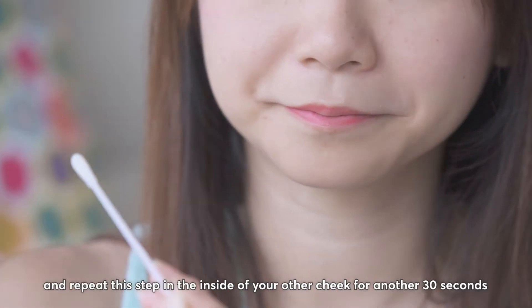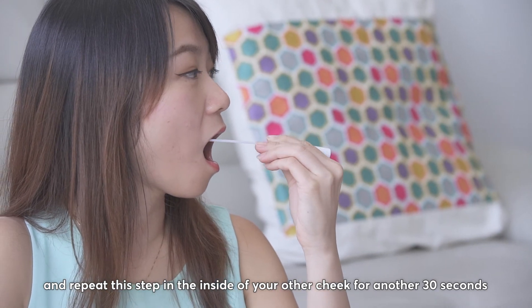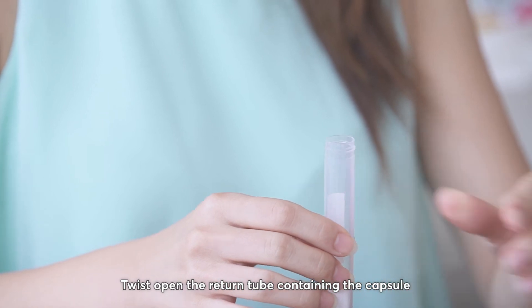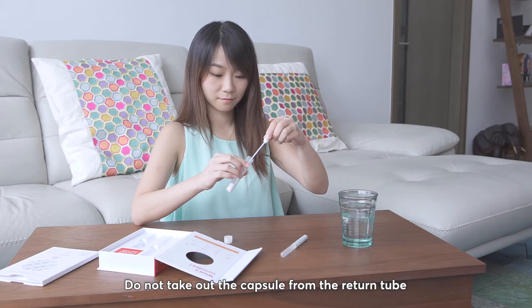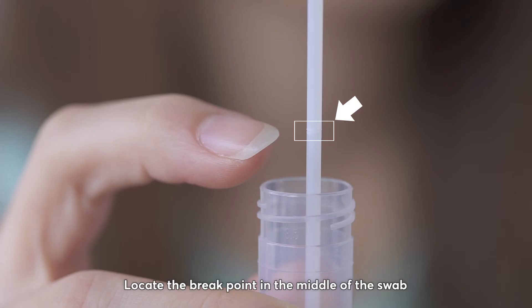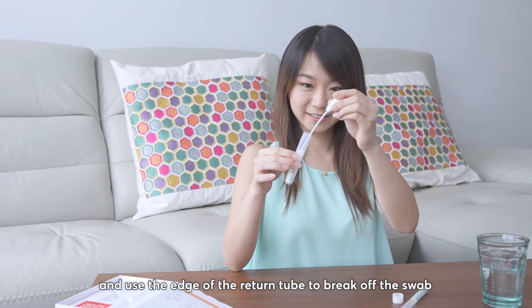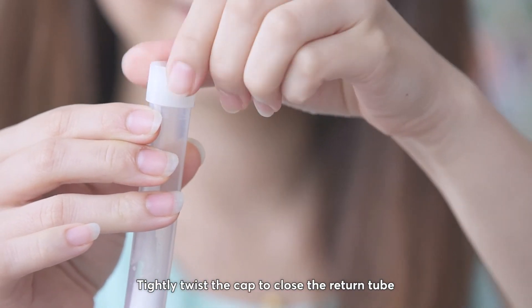Use the same swab and repeat this step on the inside of your other cheek for another 30 seconds. Twist open the return tube containing the capsule and carefully place the swab inside. Do not take out the capsule from the return tube. Locate the break point in the middle of the swab and use the edge of the return tube to break off the swab. Tightly twist the cap to close the return tube.